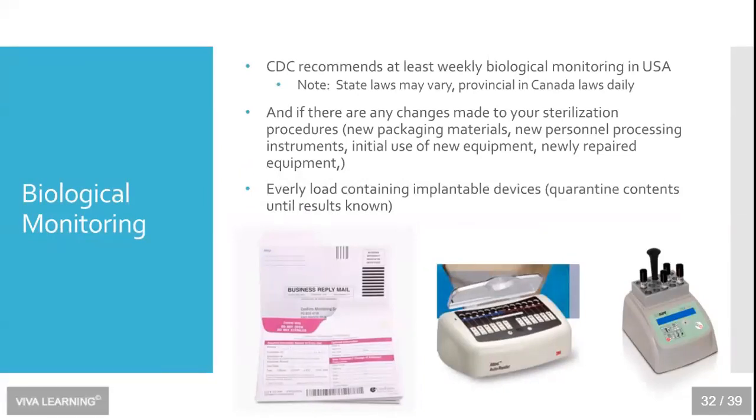Now, CDC recommends that we perform spore testing at least weekly in the United States. Some state laws vary, so check your state laws and your state dental boards. And if you're in Canada, check your provincial laws as well. And they will vary from province to province. And in other countries, keep that in mind as well. I noticed that I've got a large component of attendees from the Middle East, particularly from Saudi Arabia. And I know that in Saudi Arabia, you do indeed follow CDC guidelines as well.